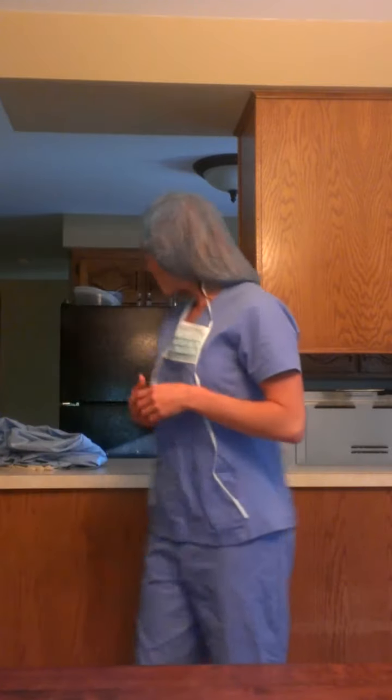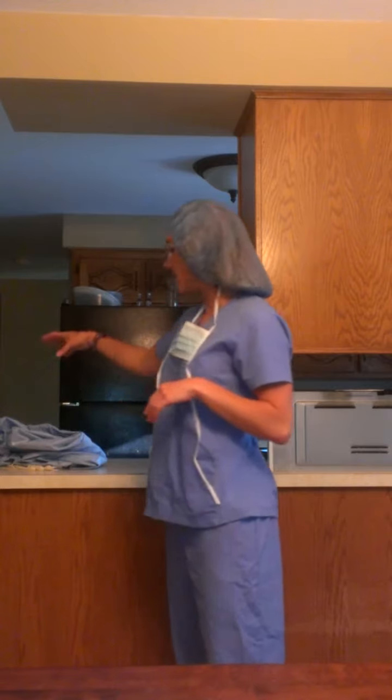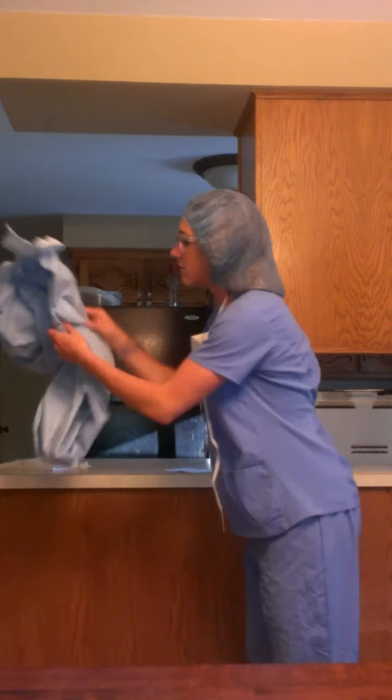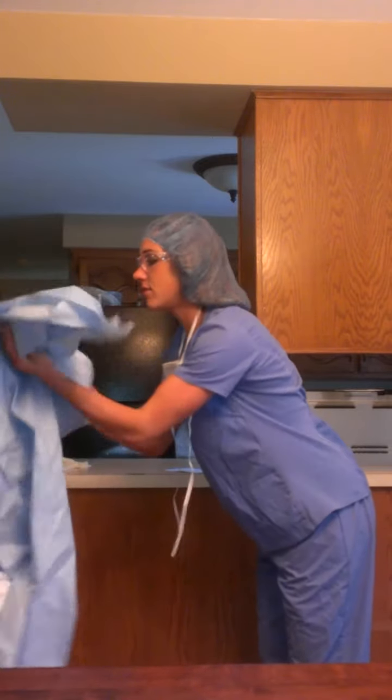You walk into the surgery room, into the operating room, into the surgical suite, it's also called that. Once you get in there, again, prior to the hand wash, you have placed a sterile gown and gloves on your Mayo stand. So you walk in, you pinch your gown, and you're slightly bent over again because your hands may still be a little bit wet, and you go ahead and put this gown on.